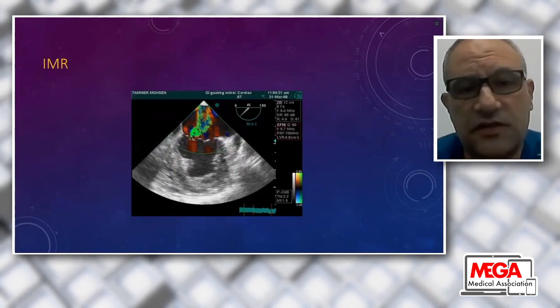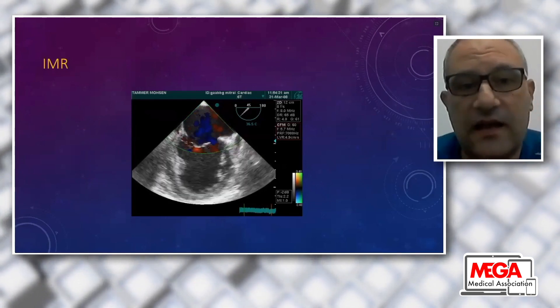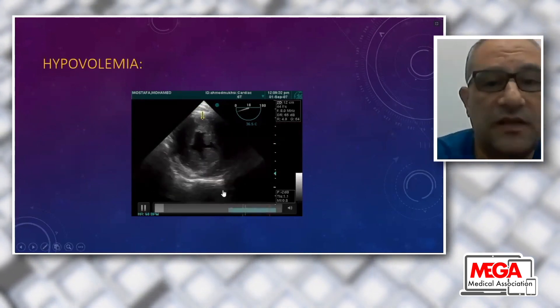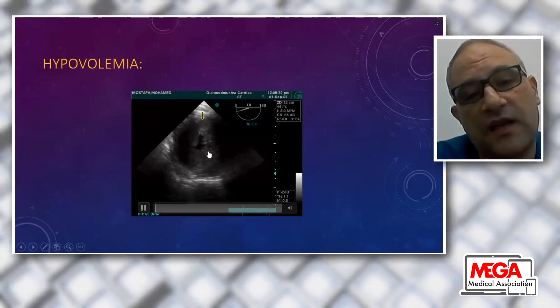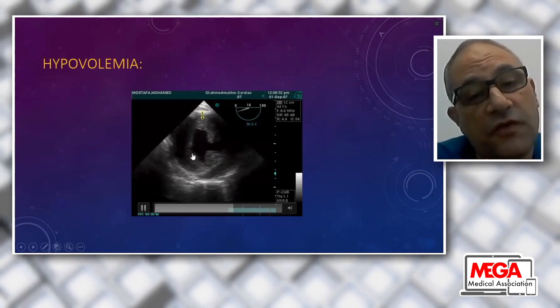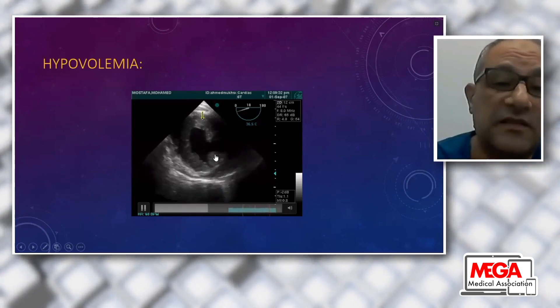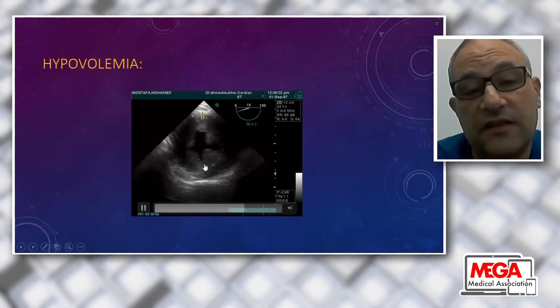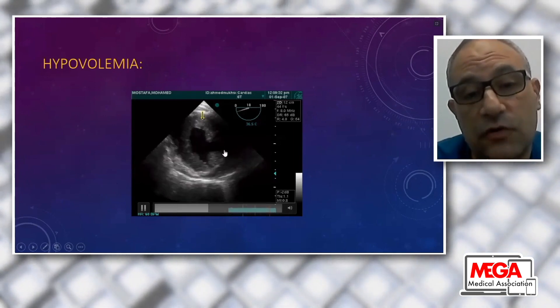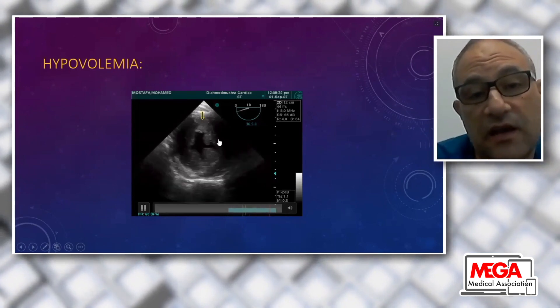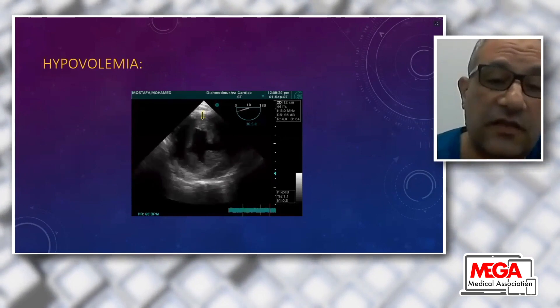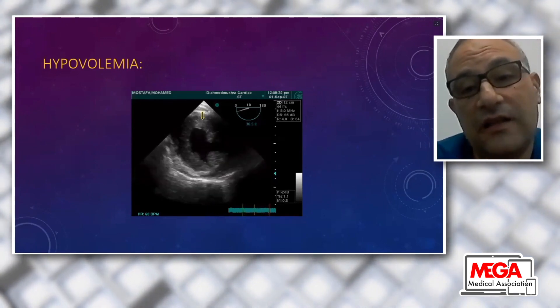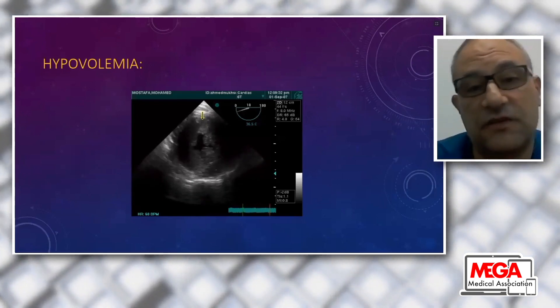With transesophageal or transthoracic echo I can detect newly developed ischemic mitral regurgitation or new segmental wall motion abnormalities. The transgastric mid-papillary view showing the kissing sign indicates hypovolemia; it also allows monitoring of left ventricular contractility. I can monitor the anterior, inferior, and lateral walls of the left ventricle simultaneously—the territories of the LAD, PDA, and circumflex—monitoring function, coronary supply, and volume from one image. By tracing the endocardial border I obtain the left ventricular end-diastolic and end-systolic areas and calculate fractional area change.